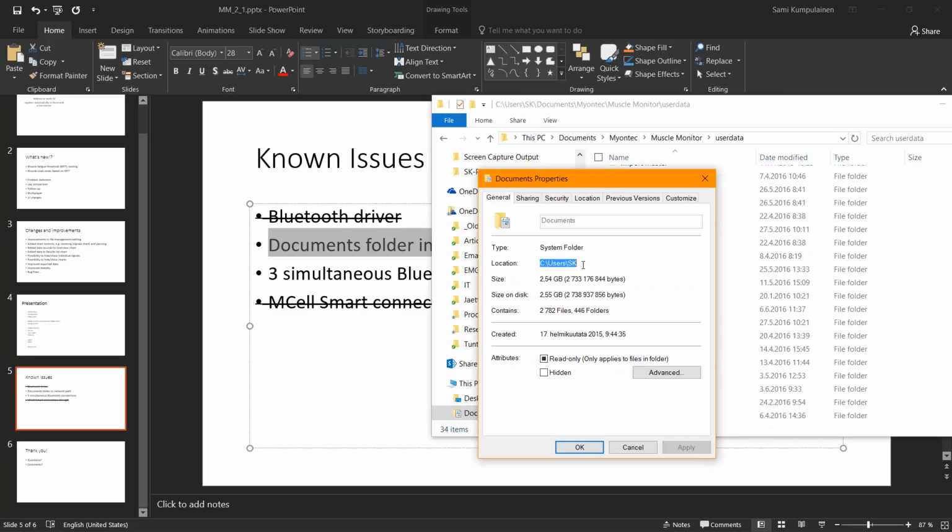When you started a new measurement, it always stopped as soon as it started, because it couldn't write to that network location. This is actually still present. We are working on a fix for that, but we are a bit wiser regarding that problem at the moment.